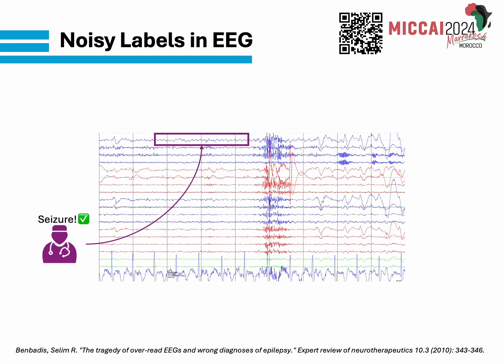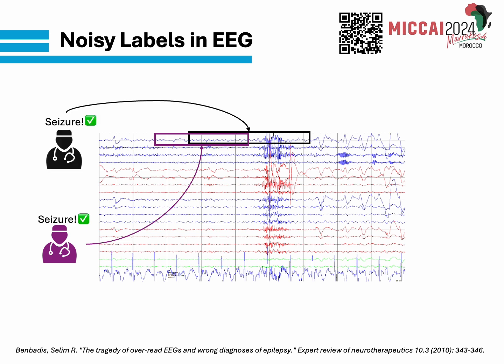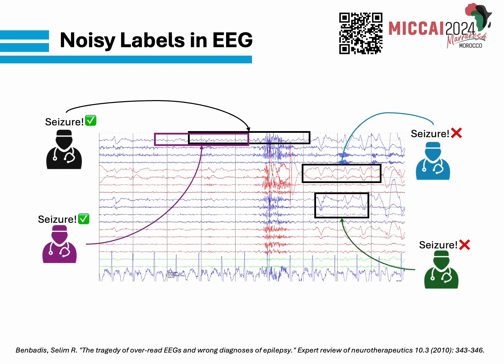However, EEG is largely known to have high amounts of confounding artifacts that resemble abnormal signatures of seizure, leading to inter-rater variability in the dataset. In really noisy time points, the labels could be entirely wrong, leading to over-segmented seizures. Now, the deep models that are trained to detect seizures using these noisy labels end up being highly prone to learning wrong characteristics and producing several false positives during the testing phase.